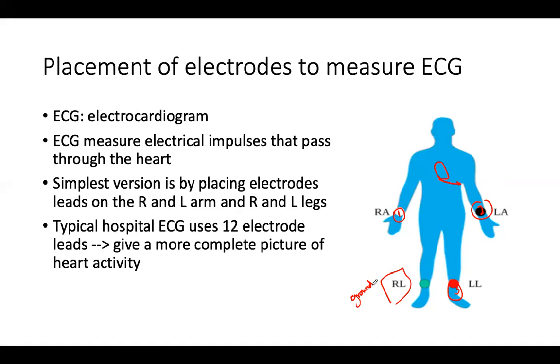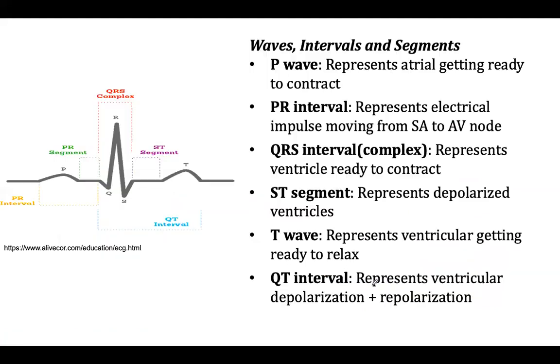Again, how is that data collected? I'm not getting into the physics behind that. All I need you to understand is that when I connect these 4 electrodes to my subject, I will create something that resembles this, which is called an ECG.